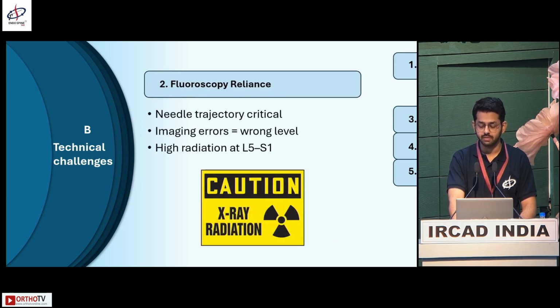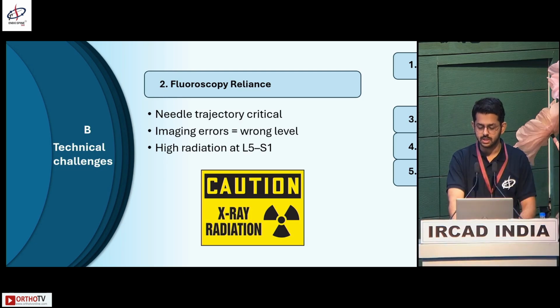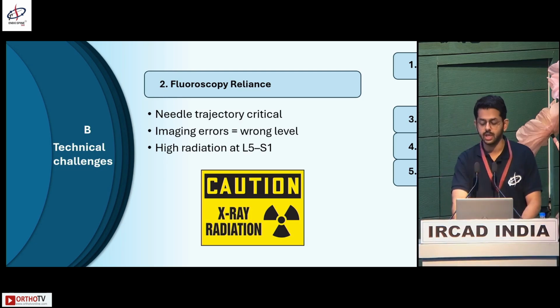Fluoroscopy is essential for safe access. Misinterpreting images can result in incorrect docking and incomplete decompression. At L5-S1, the need for repeated fluoroscopic adjustment increases the radiation exposure. Using pre-op images wisely minimizes shots, and even considering a navigation system where available can reduce this risk.